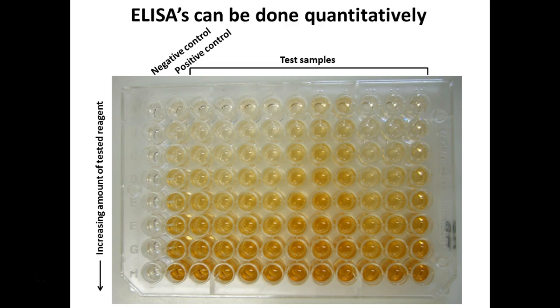I would take a serum sample and run this test just like you guys are doing, but I would use Mycobacterium leprae antigens in my wells, and I would use the antibodies from the armadillos, and their sample would attach. I'd use a second antibody with an enzyme attached and add the substrate, and I would get color changes that I would read. And for us, a positive result, I think, had to be like 700 or higher, based on the control standard we would run.